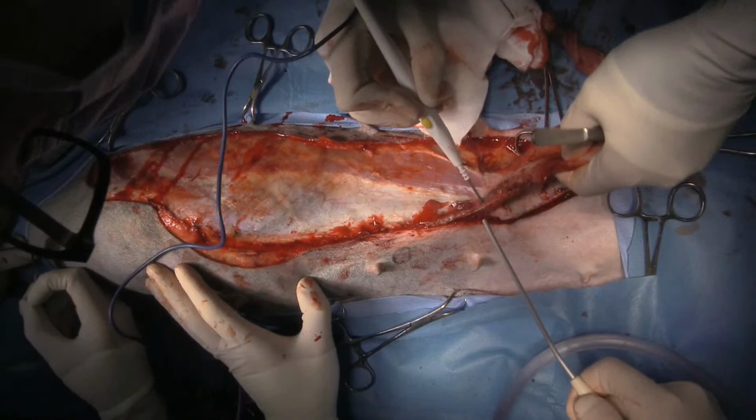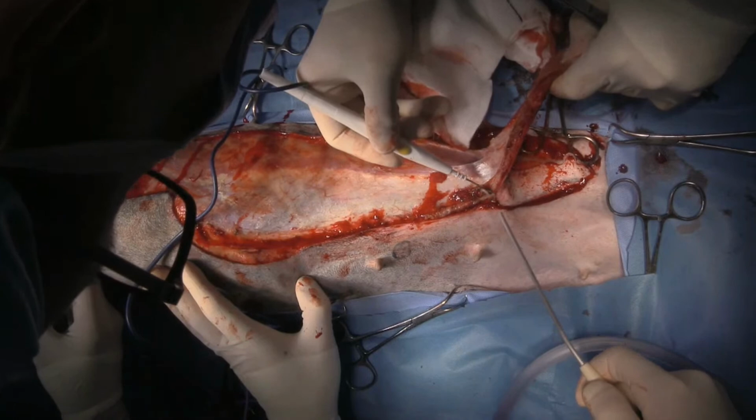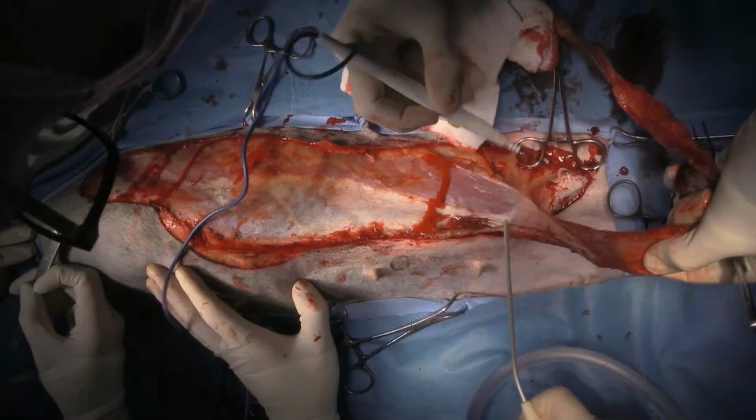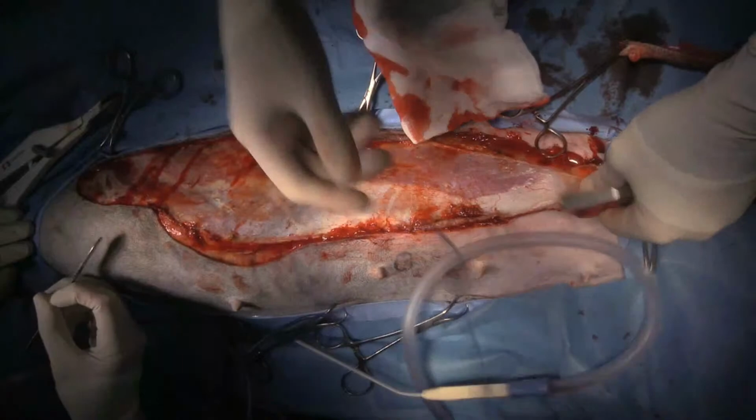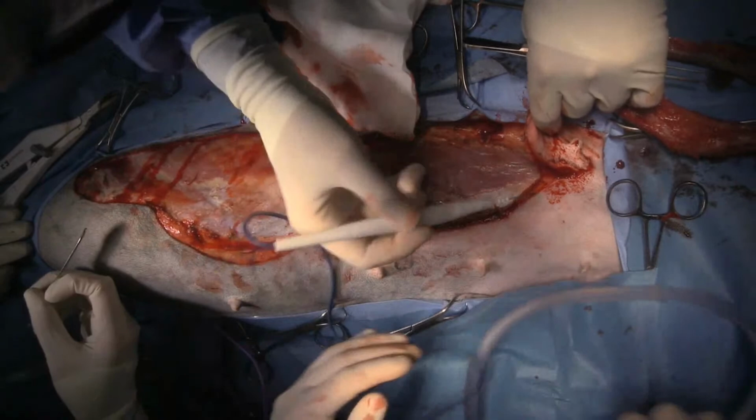Can I get some OPDS, please? There's a question that says, what wide margins from the lumps do you need to take for a mastectomy? So from the masses themselves, you want to get a couple of centimeters. On the mammary chain, you just basically need to get the nipples out and the majority of the mammary gland tissue.